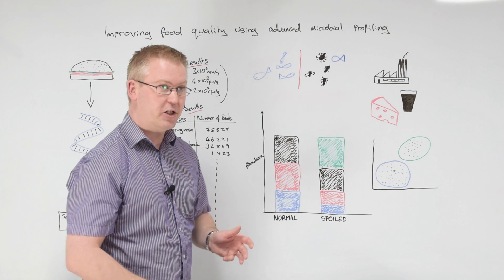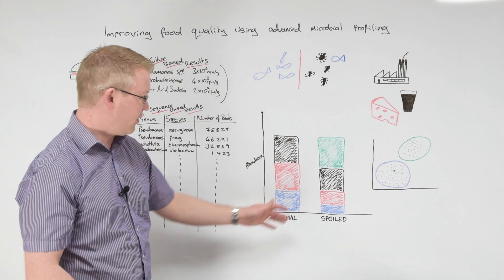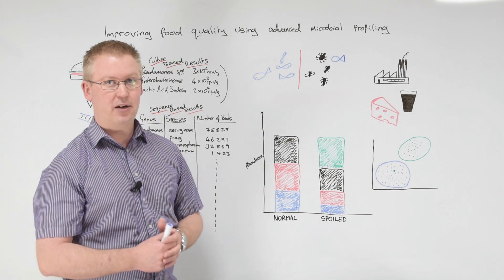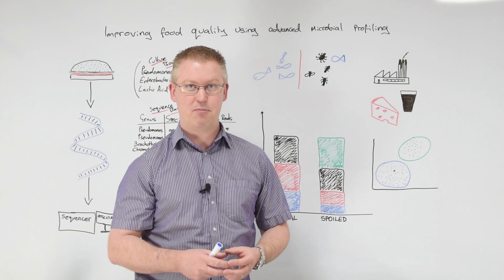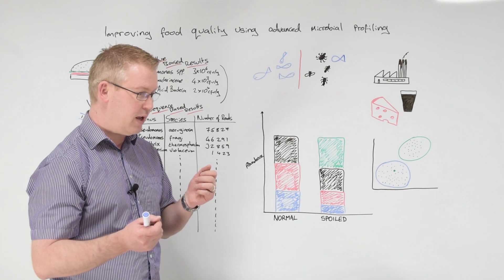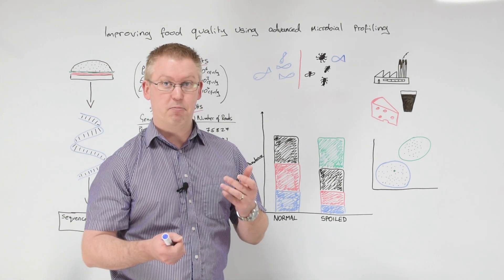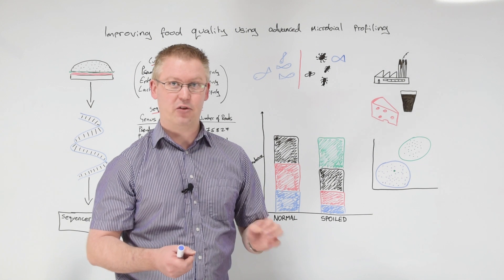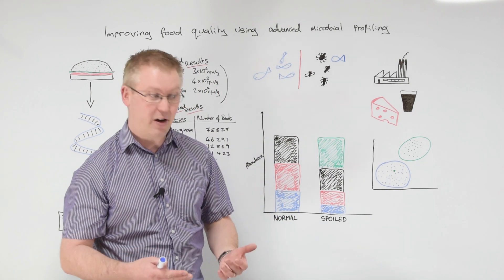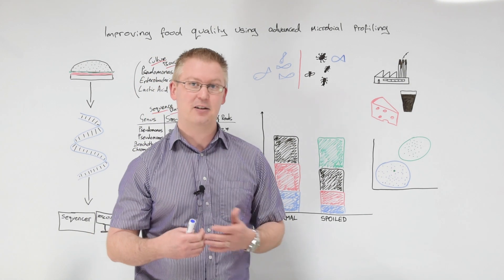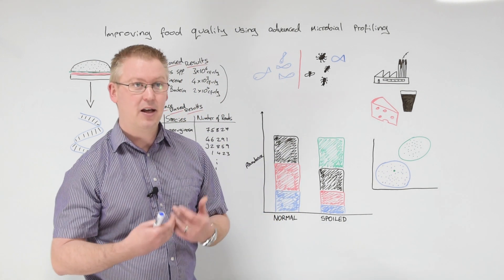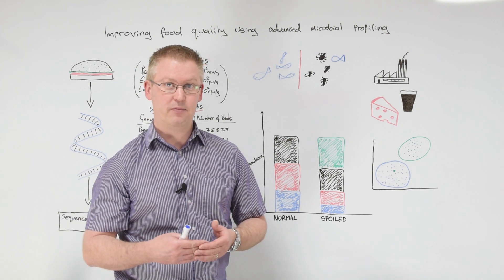We can also use this for spoilage investigations as well. So here we have a diagram based on some work we did for a client. And in this particular case, what we had was some chicken. It was basically a chicken breast in a modified atmosphere packet. And the chicken breast was spoiling. It was going blue. There were some blue patches on the surface of that chicken breast. And the first thought was, well, are these blue patches maybe dyes? Has there been some leaching of a dye from the packaging into the product? And our chemists confirmed that that was not the case. So we got hold of the product and ran a spoilage investigation using AMP.